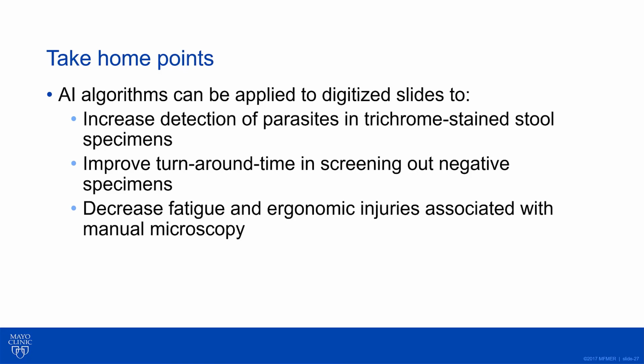And we could in this manner decrease fatigue and ergonomic injuries associated with the manual microscopy of reviewing all those negative slides manually. And this does improve technologist job satisfaction. So we are very excited that we're going to be implementing this. We feel it's going to improve our processes, and we wanted to provide this information for other laboratories that may also be interested in providing this in their setting for their patients.